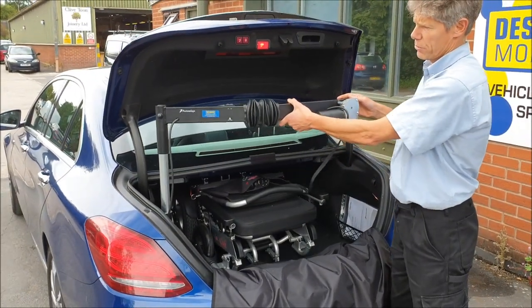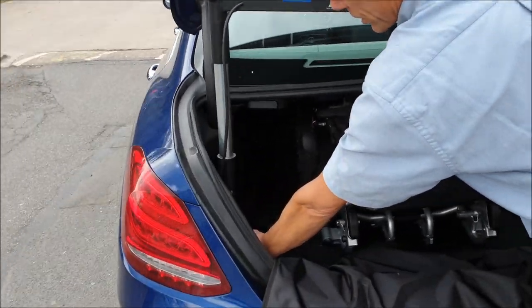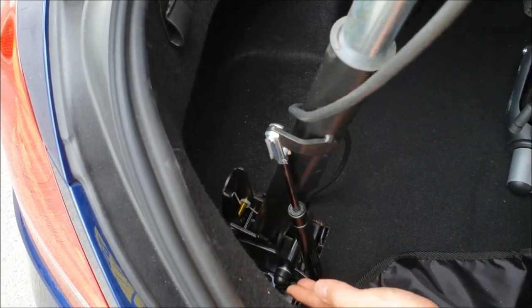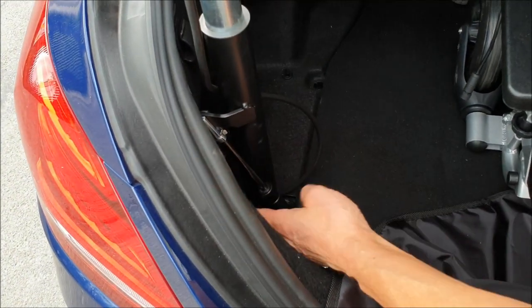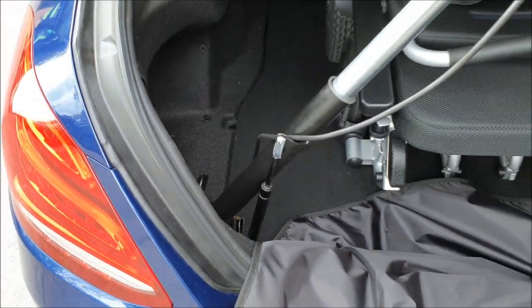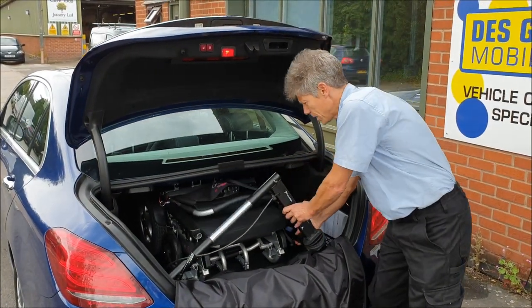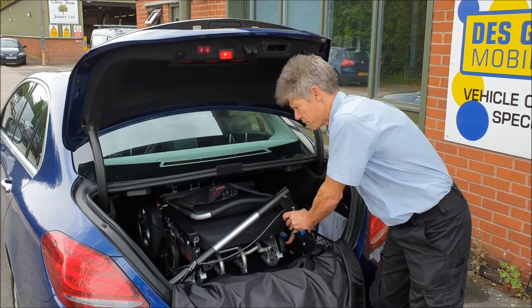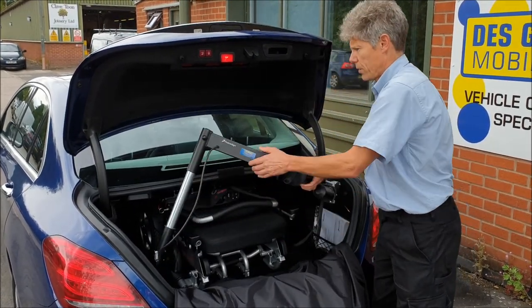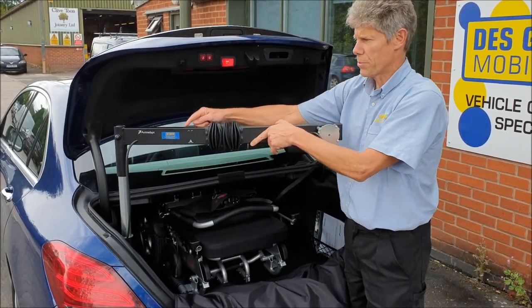We fold up the hoist like this — it's got a little locking mechanism. That's to unlock there, and that just locks up. It's got a gas strut here which makes it nice and light to operate, so as that drops down it's nice and easy. All we do is drop it down into the boot and shut the boot. Just fold that up and lock to position like that — that's our little lock-down switch there.